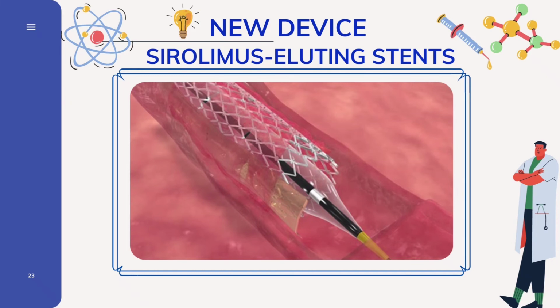Stents were conceived to make balloon angioplasty safer and more effective. They controlled elastic recoil and negative remodeling, but also stimulated the cellular mechanisms yielding in-stent restenosis. Restenosis after bare metal stenting, or BMS, is mostly due to neointimal proliferation. It was a purely mechanical solution to an important biological problem.